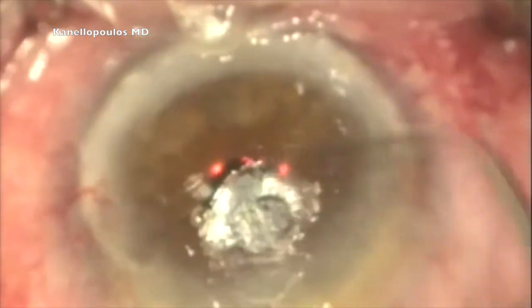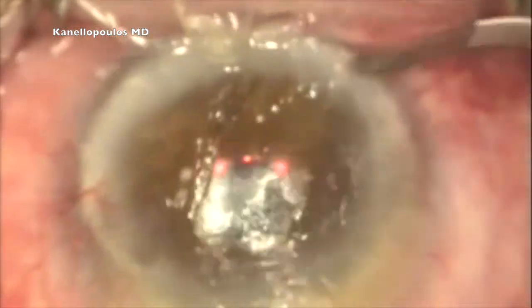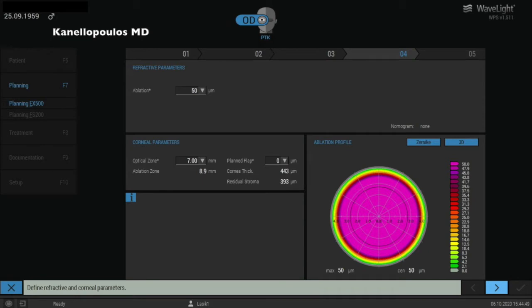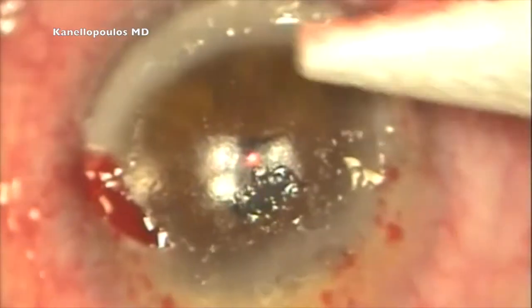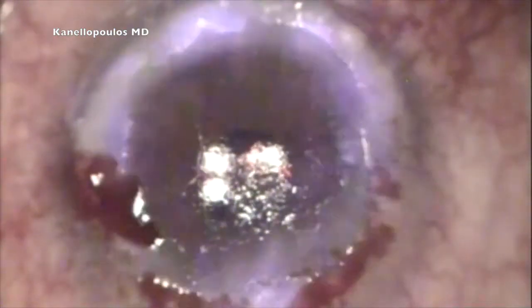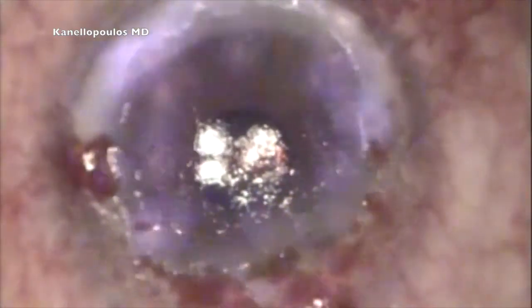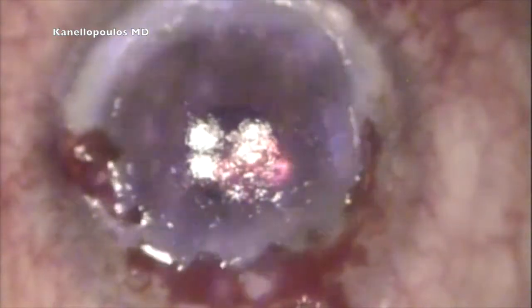I'll do the same with the other satellite lesions from the central cornea. Then we're going to employ our EX500 Excimer laser by Wavelight Alcon to perform a 50-micron, 7-millimeter diameter PTK. I know this version of software is not available in the U.S. version of the laser. You can see how we have a little bit of oozing from the paralimbal area. So we're trying to normalize the surface after the superficial keratectomy. We deepithelialized the cornea.